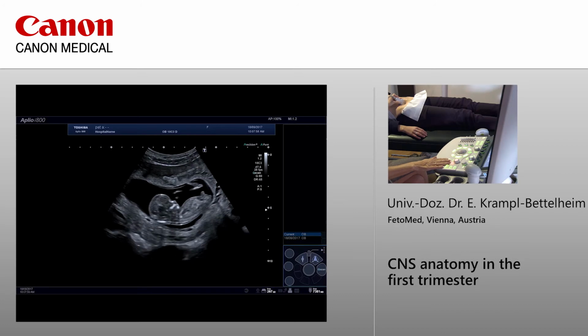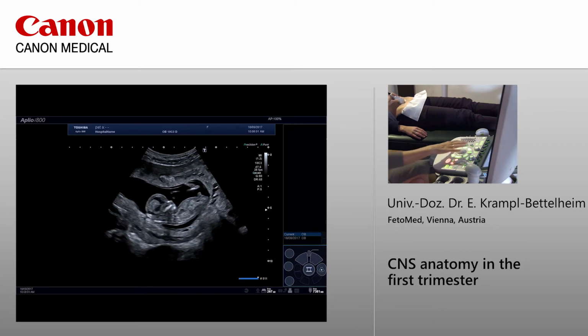And then I usually check the size of the baby fairly early so that I'm really aware of what to expect in terms of development. So a bit more than 6 centimeters CRL, about 12 weeks.